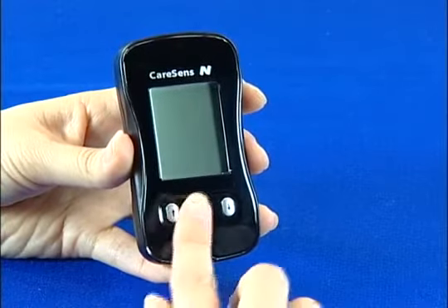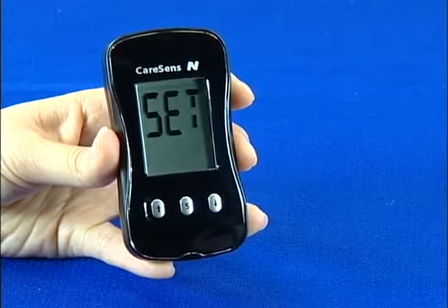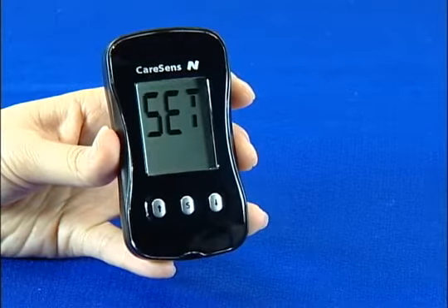To go into the set mode, press the S button for 3 seconds. All symbols will show for 1 second before the word SET is displayed.